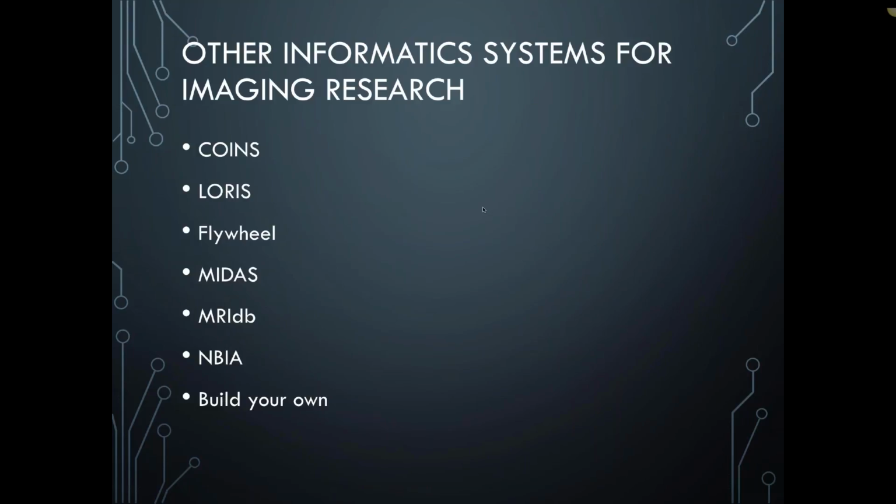I'm going to be talking a lot about XNAT because it's the system I know best, but it's important to note that there's actually quite a few different informatics systems to support imaging research. Here's some of them. COINS, LORIS, and Flywheel are primarily used within the neuroimaging community.